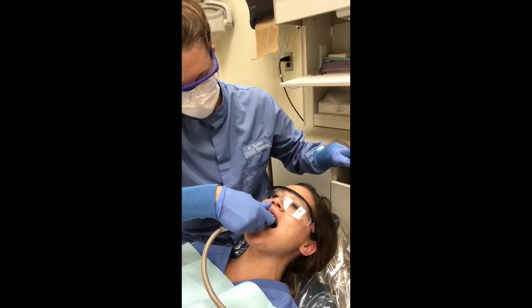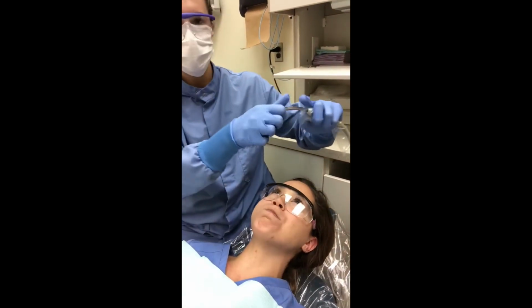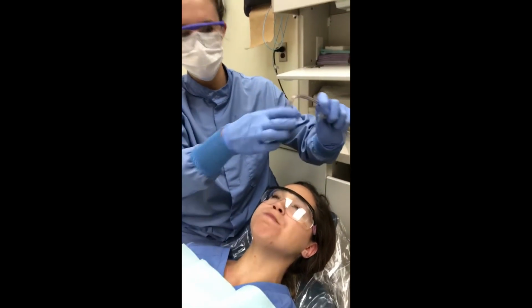So your patient, I'm going to give you some water, just swish that water around, and then I'll suction it up with the Slurpee suction, whatever you want to call it.